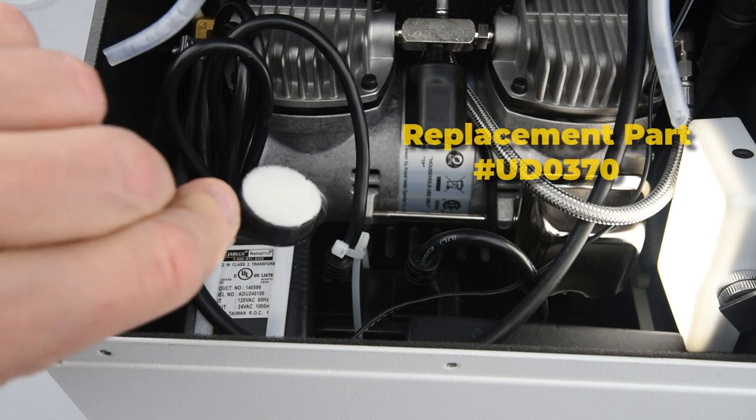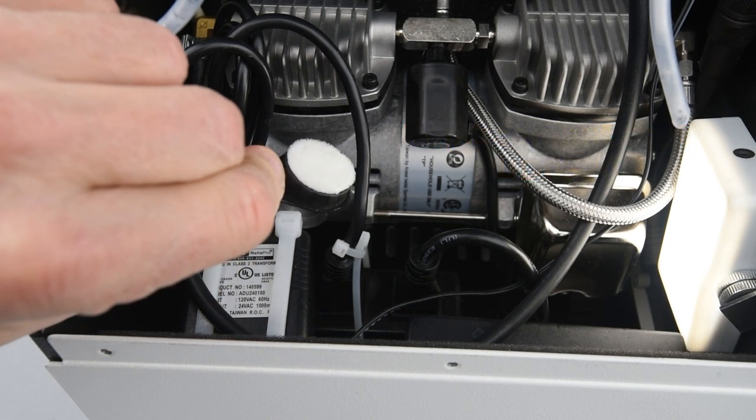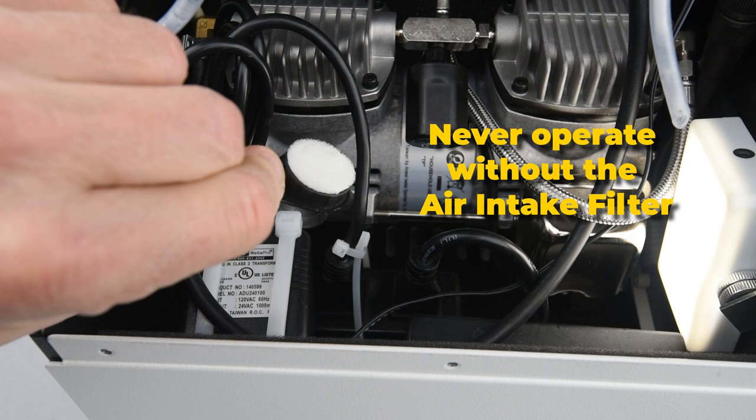Inspect the air intake filter every month. A dirty filter can hinder the compressor's performance. Keep it clean at all times. Remember, never operate without the air intake filter.